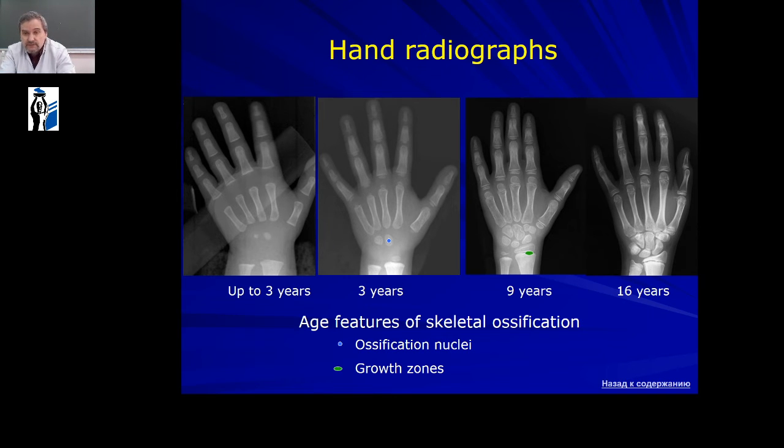On this picture, we can see hand radiographs from a child of different ages, up to 3 years, then 3 years, 9 years, and 16 years.